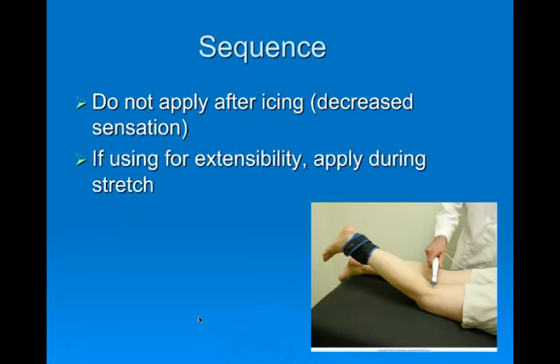Sequence of treatment. We always get asked the question, people will ice and then do ultrasound. Not the best idea. I did pull the documentation up for this, but as you can imagine, we're trying to heat something. If we cool it down first, it's not going to get as hot. So, a little problematic there. As well, you're also going to decrease the sensation, so you're increasing your risk of a burn. So, probably not a good idea, even though you'll see this done in clinics, kind of an old school technique.